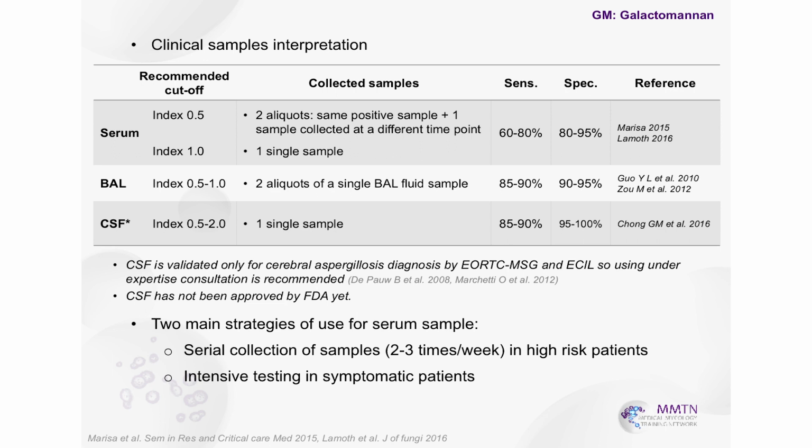Here, FDA approved as a diagnostic aid for invasive aspergillosis. This is one thing. When you do the galactomannan EIA, you still have the problem, right? This is semi-quantitative. They have the cutoff. It's too slow. How many hours for this one? Half day. You don't write, right? It's too slow, eh? Yeah, he's smiling.